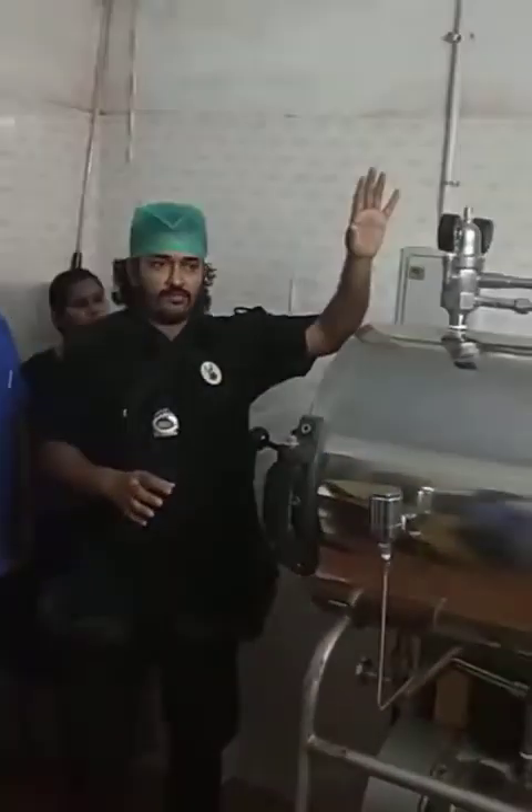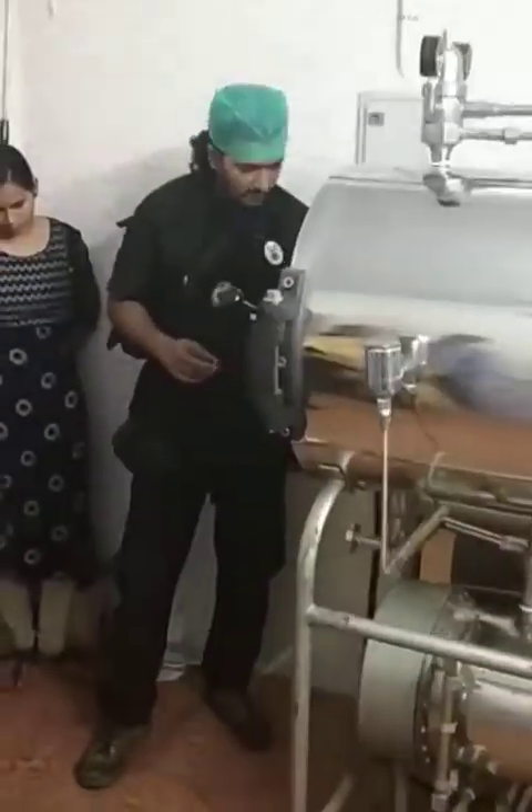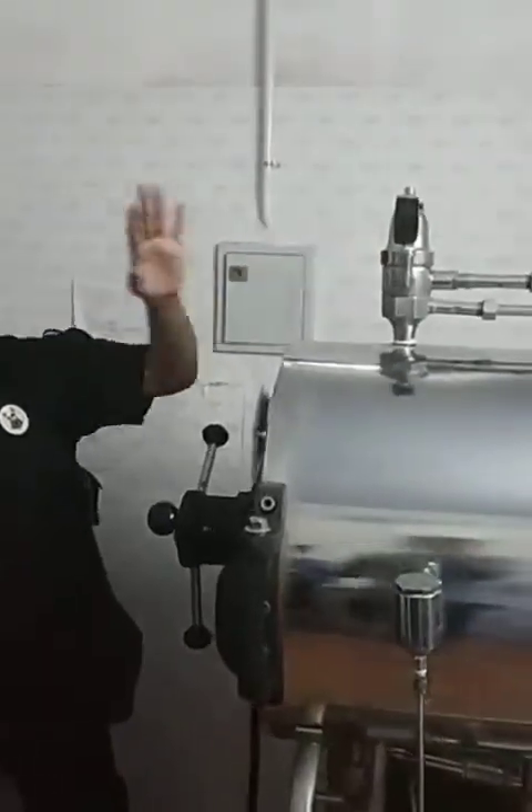It is called a gravity displacement autoclave. It is a big sterilizing equipment. So let's try to understand. First thing is it needs a three-phase power supply. Second thing is we have two pressure indicators over here.